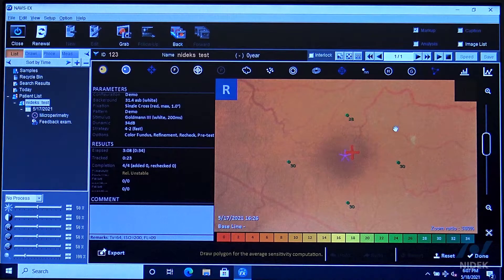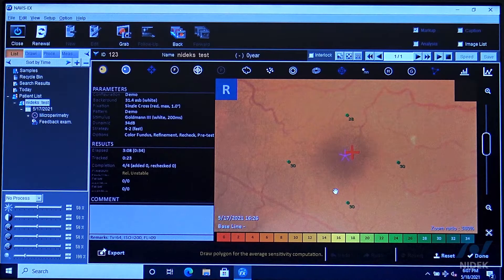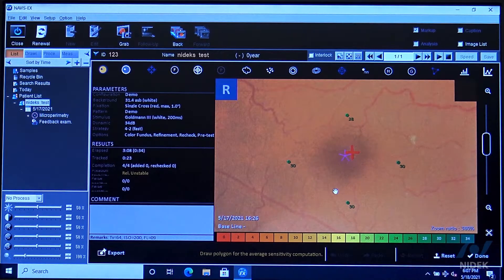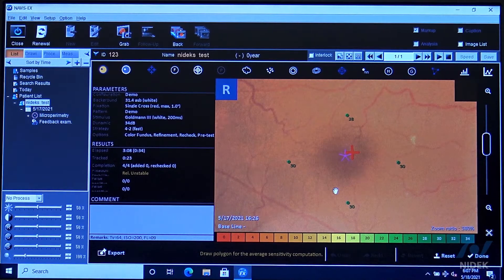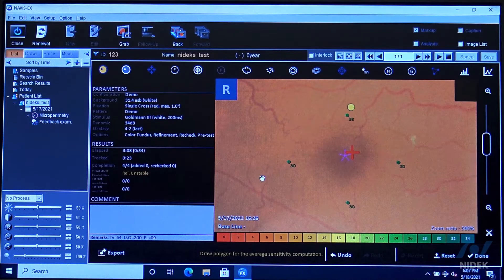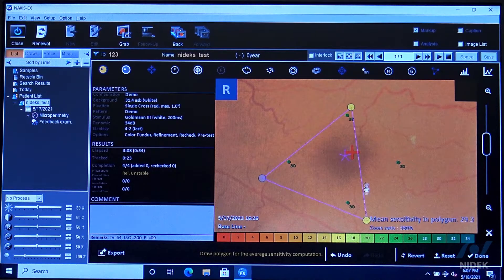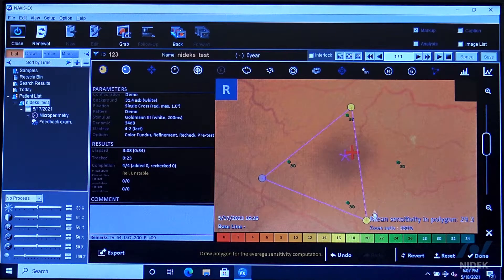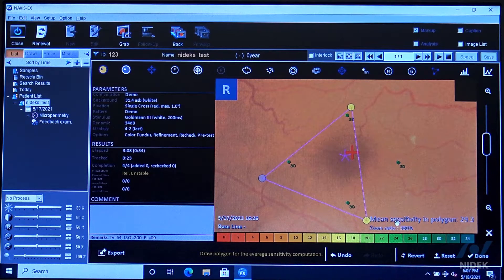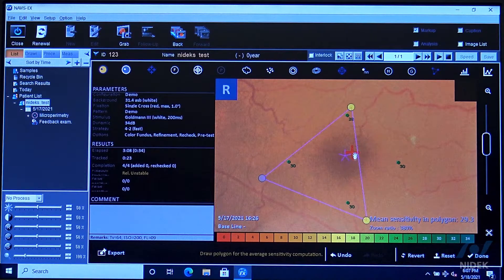We can also look at the simulation map of what the shape and size of the scotoma would be. We can also look at the polygon or the average sensitivity within that polygon by drawing out a polygon. Now this is the mean sensitivity and the polygon is 29.3.